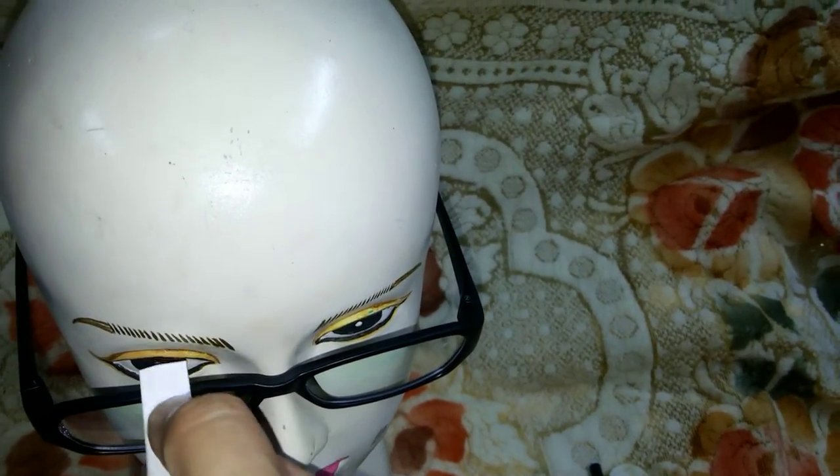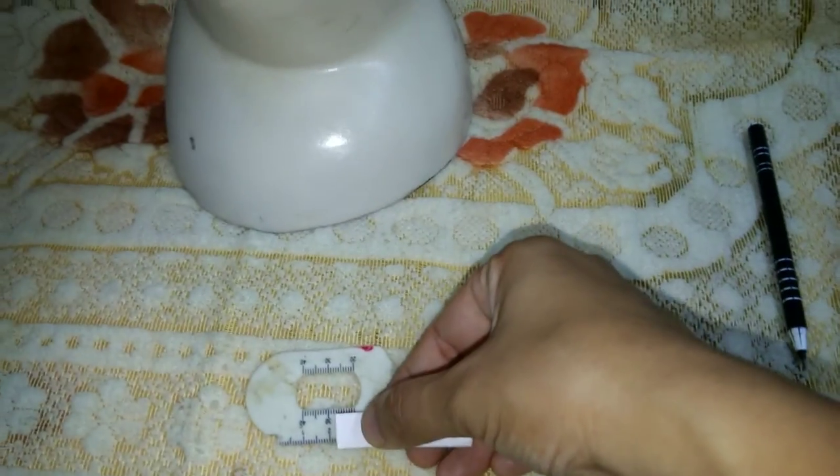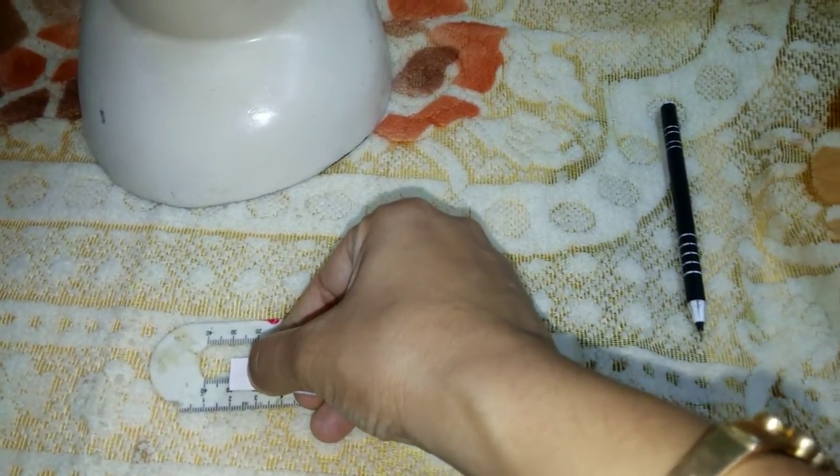in this case the measurement is this much. Now take a scale — on the scale you can take the length of the measurement. What is the measurement? In this case it is around 10 mm. It is 10 mm.